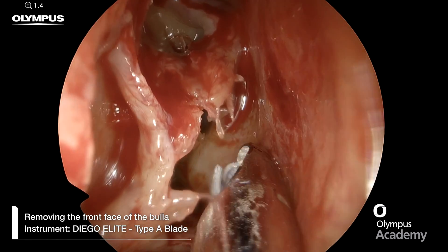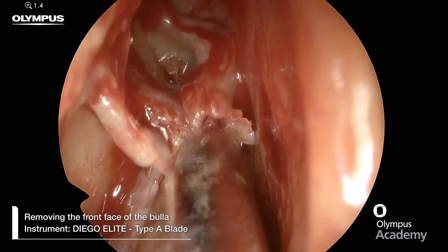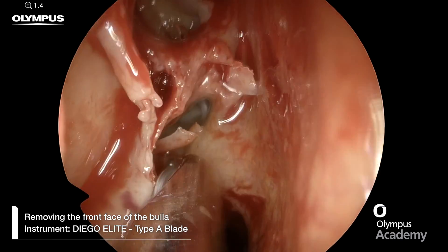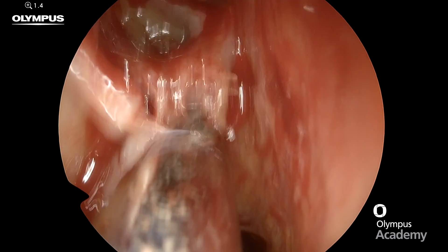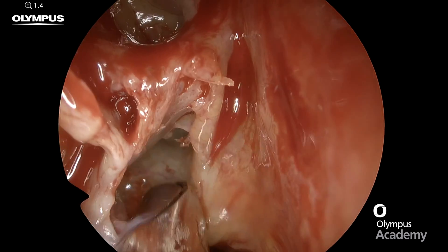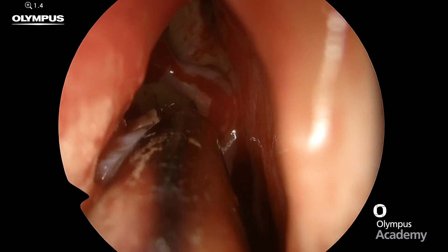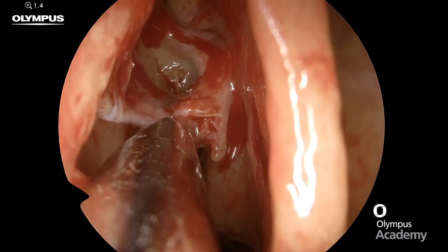We can now remove the fragments of that anterior wall of the bulla using a microdebrider. I'm using the type A blade, which is the more aggressive variety of the Olympus Diego Elite. You can see here it really makes small work of removing these fairly large bony fragments.